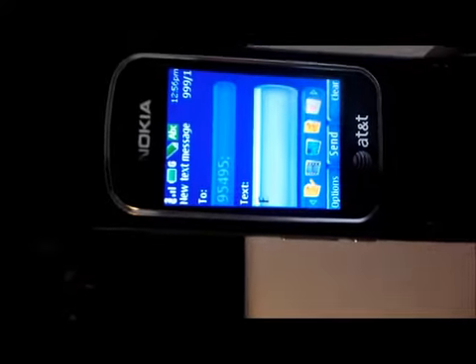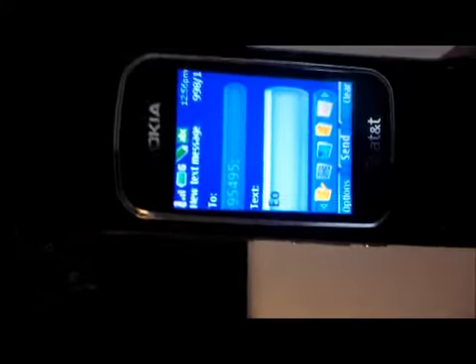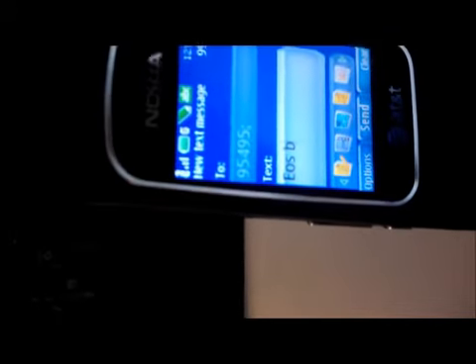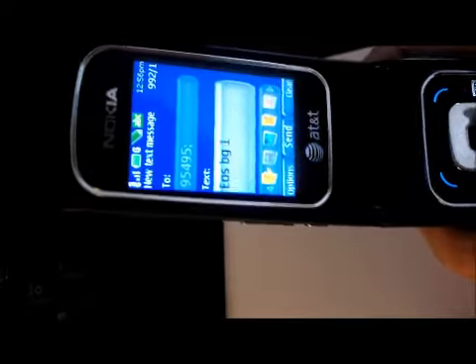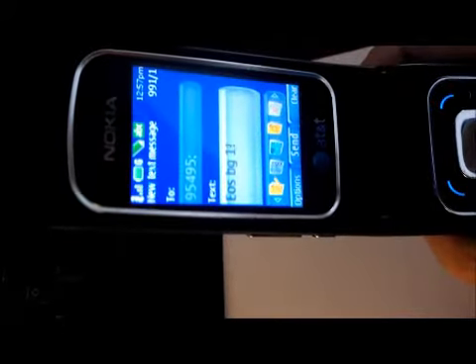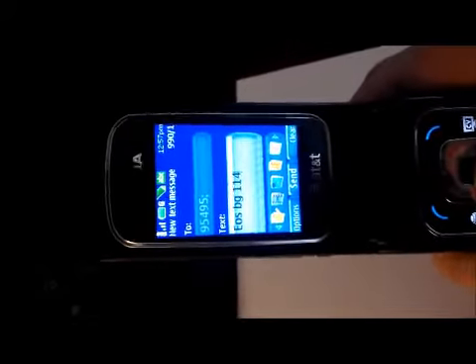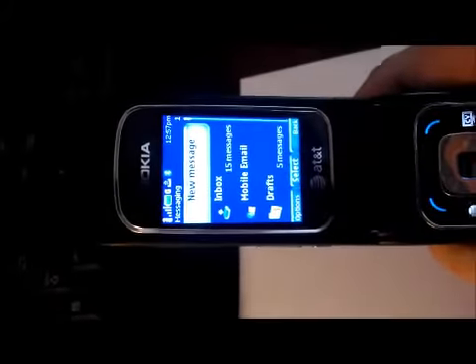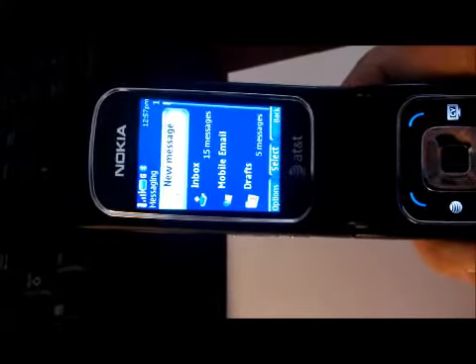And here I'm going to put EOS just to be able to identify the database, with a space, and then BG for blood glucose. And in this particular case it was 114. And then I'm simply going to send it, and it goes to the database. It will be sent, and it will appear in the database, as well as a message to confirm it will appear back on the phone.